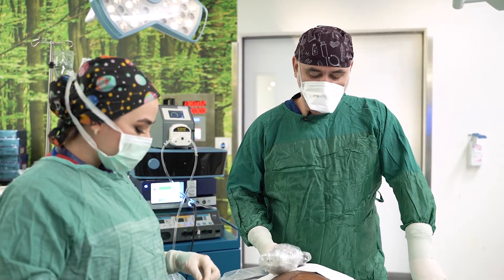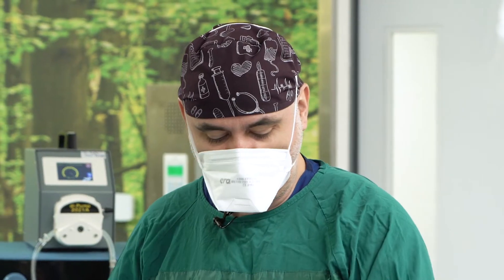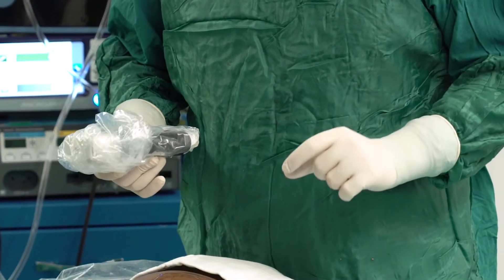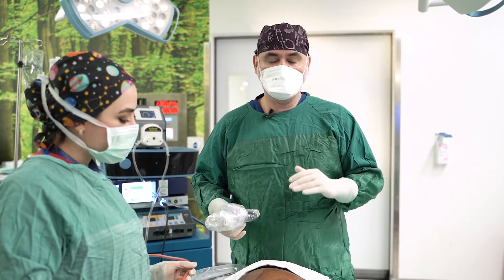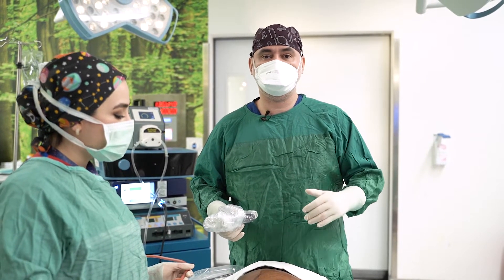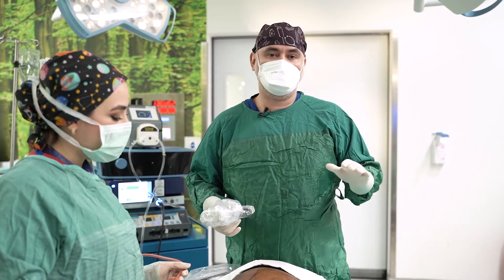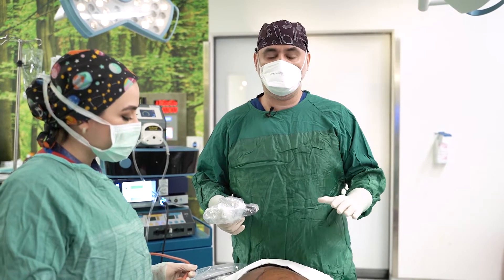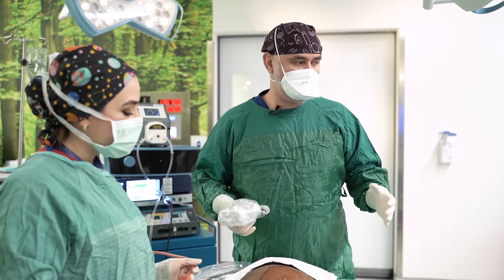Hello again. I want to give brief information about the safe BBL technique. We have aspirated the fat from this area and we are starting to inject the fat into the butt region. In the safe BBL, we inject the fat between the muscle and the skin region — we do not inject the fat inside the muscle area because there are large arteries and veins. We don't want any embolism risk, and that is why we apply the safe BBL technique.